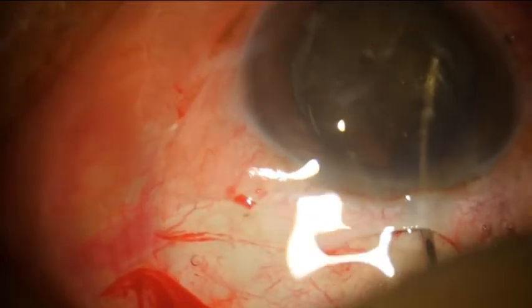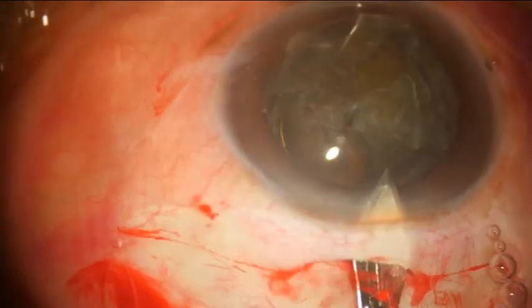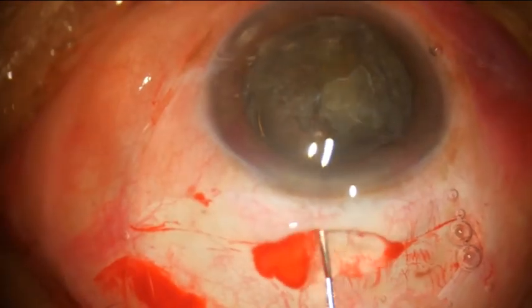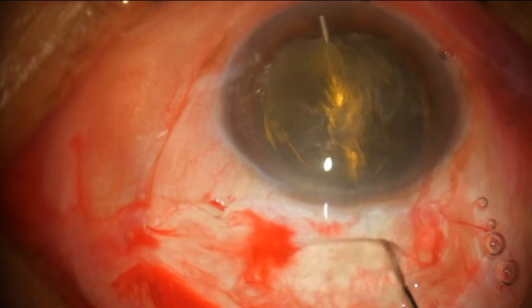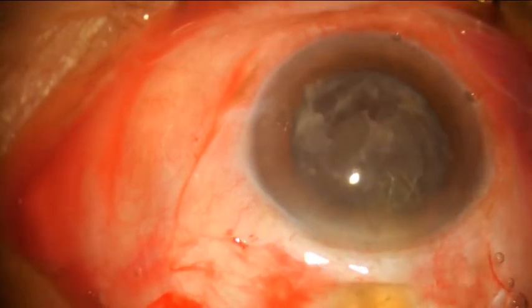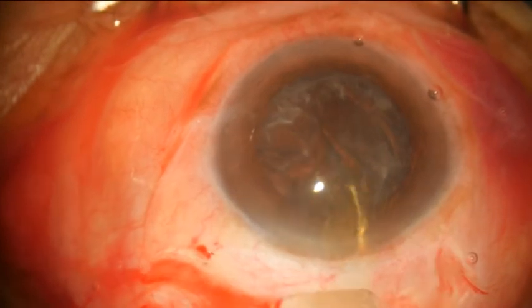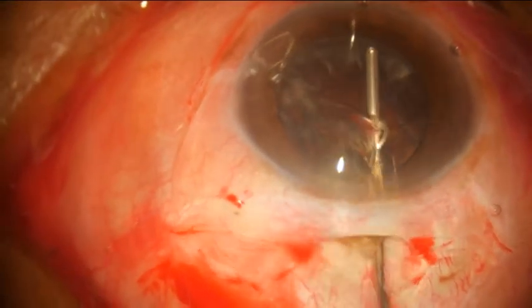Then a hydrodissection is done. If the nucleus pops out and you can see the nice glow around it, you simply go ahead and complete your incision. Once the nucleus is in the anterior chamber, you can express it out by either visco or by hydro pressure, pressing on the lower lip of the wound.